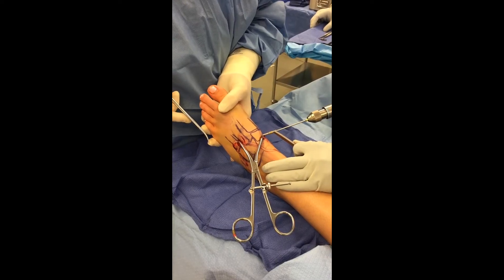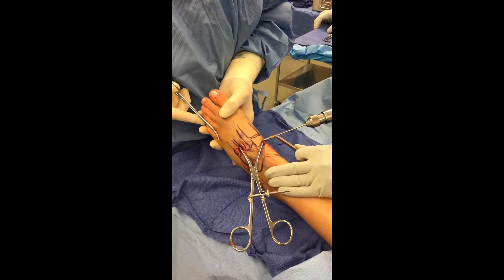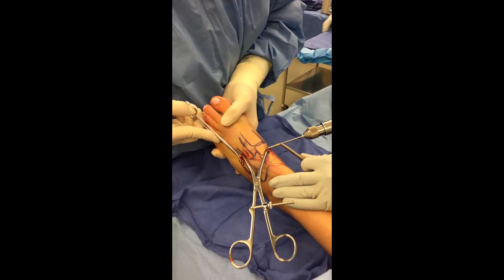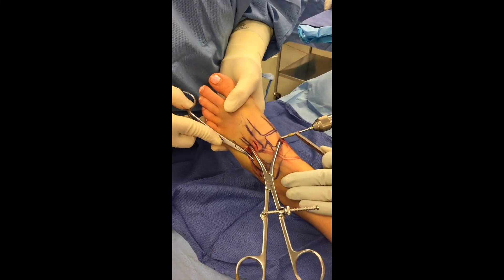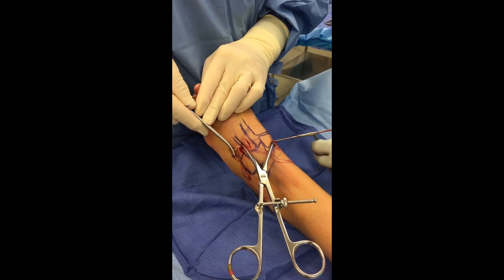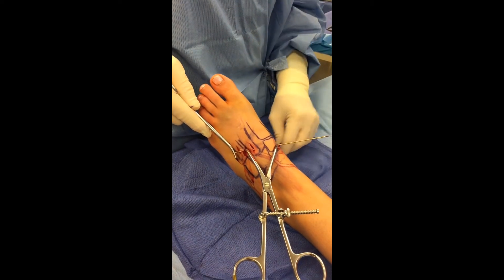Once this is checked fluoroscopically, a small incision is made over the pin site and the pin is overdrilled. As the guide pin penetrates through the incision over the dorsum of the foot, this can be held with a hemostat or needle driver so that when the drill is removed, the pin positioning is not lost.